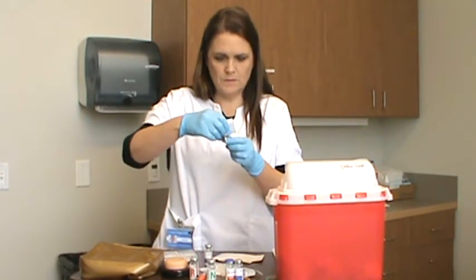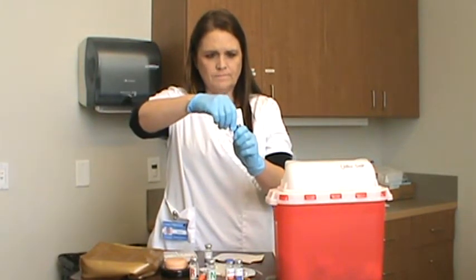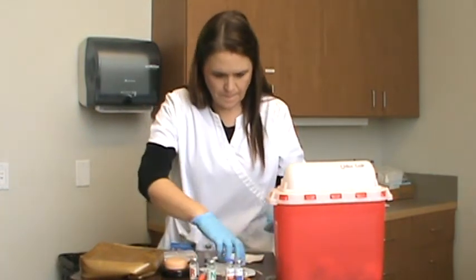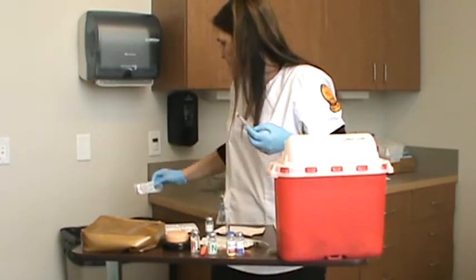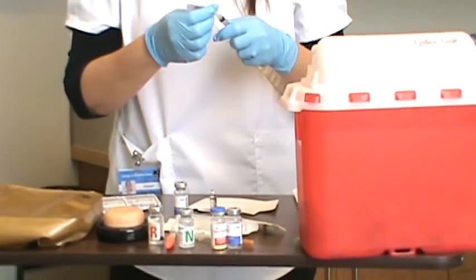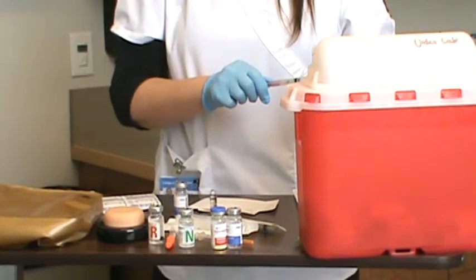Put it in here and break the top away from me. Put that in the sharps container. Then I would use a filter needle to draw that up with, because there might be glass particles in there, and I don't want to draw up any glass.